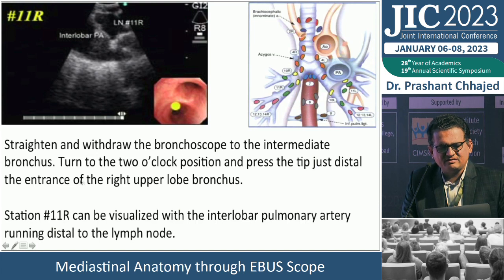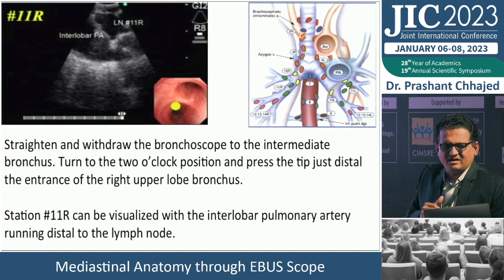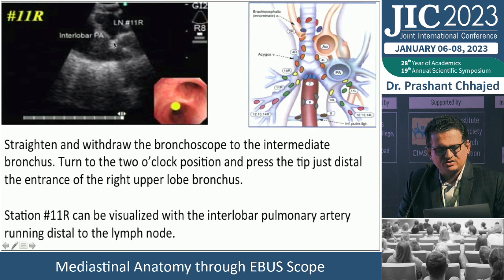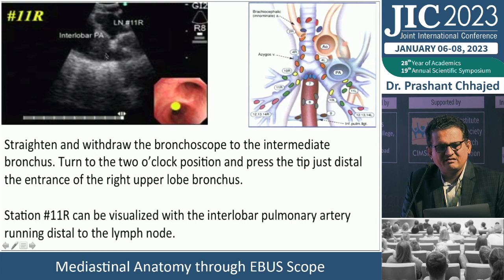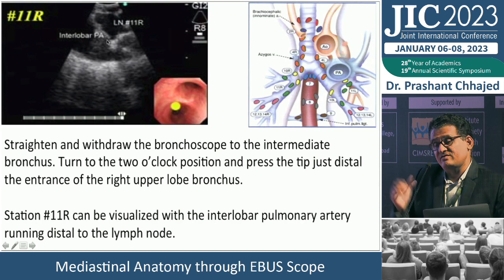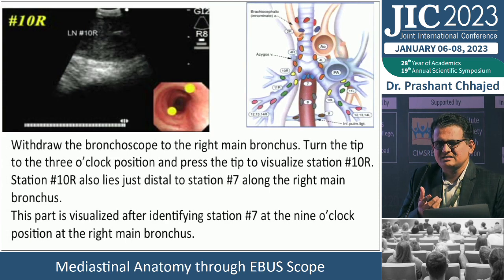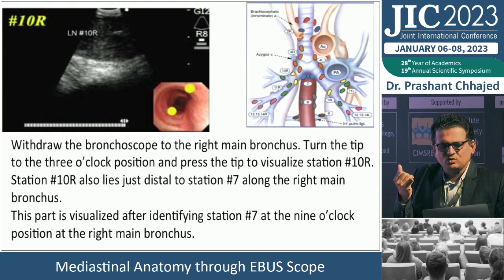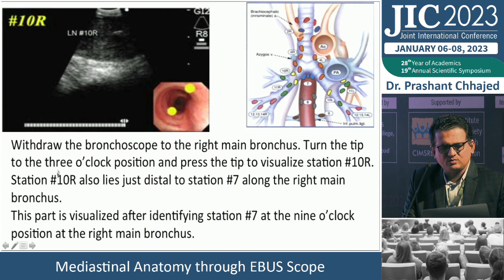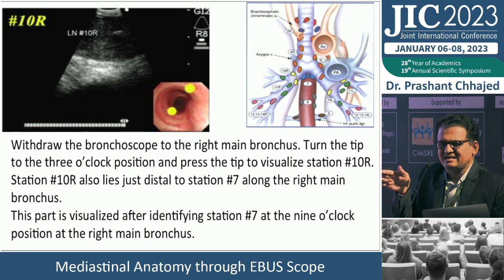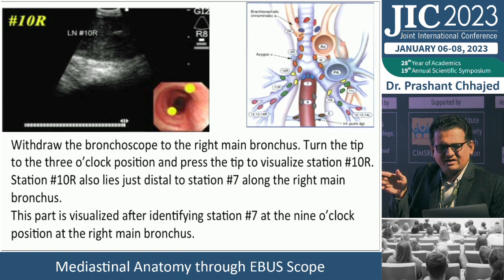Turn to the 2 o'clock position, press the tip distal to the entrance of the right upper lobe — that is where you identify station 11R, associated with the interlobar pulmonary artery running distally. If there is no lymph node, you will only see the artery. After station 11, withdraw the scope. Turn to the 3 o'clock position in the right main bronchus to visualize station 10R. Station 10R is visualized after identifying station 7 at the 9 o'clock position.